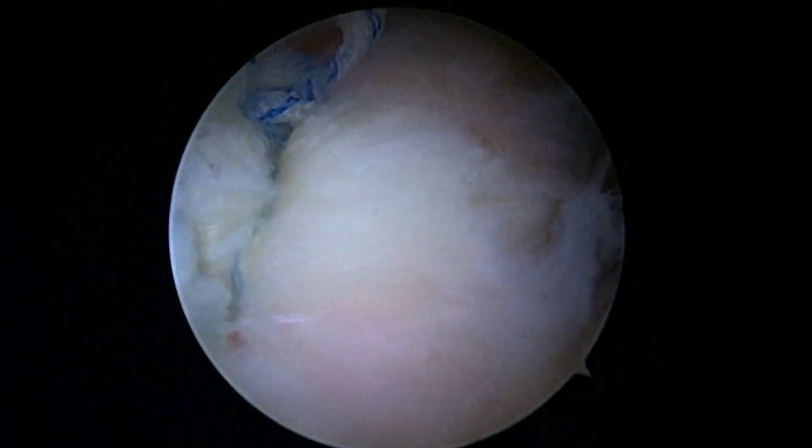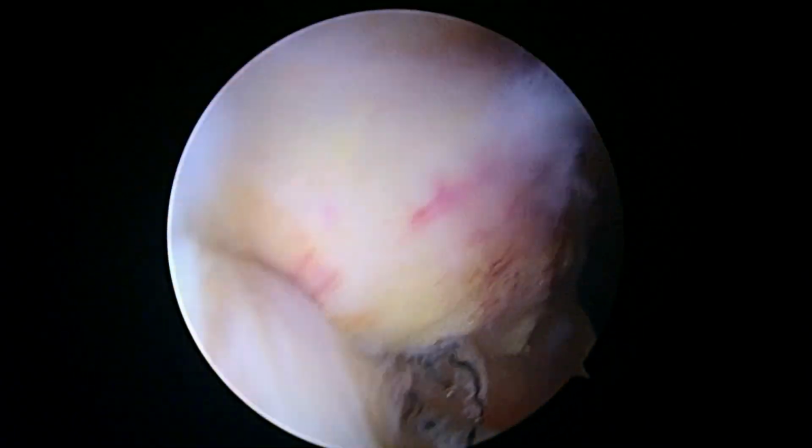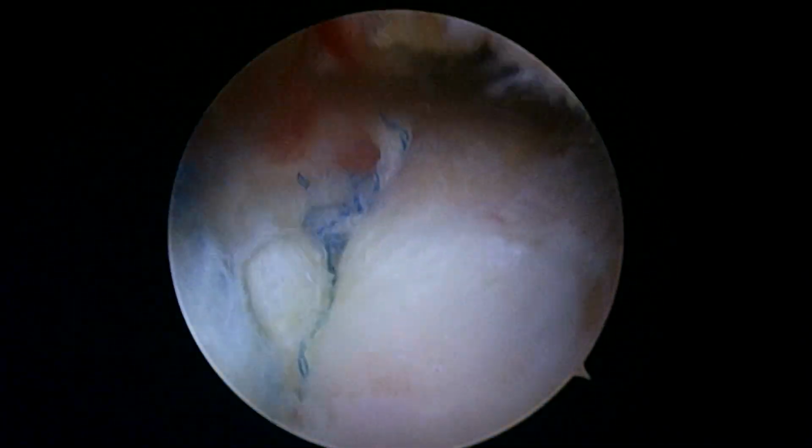Okay, we're all done. Here's the cuff repair. We've got 3 strong sutures tied. There's one in the back there. You can see it right there. There's number 2. There's number 3. That hole's completely eliminated.